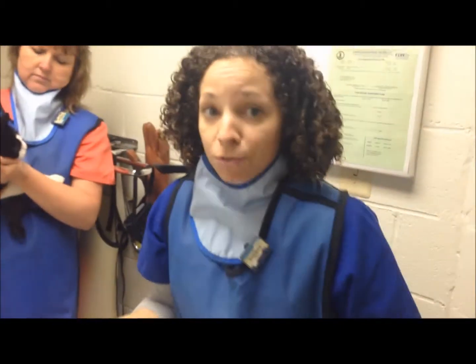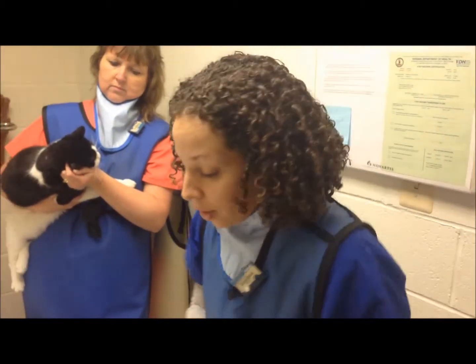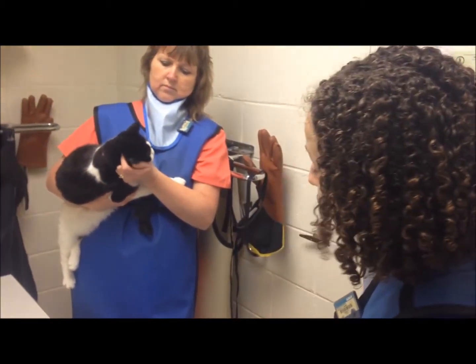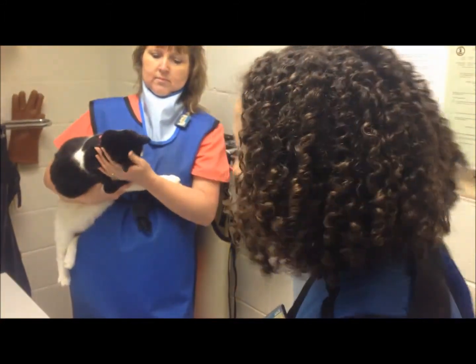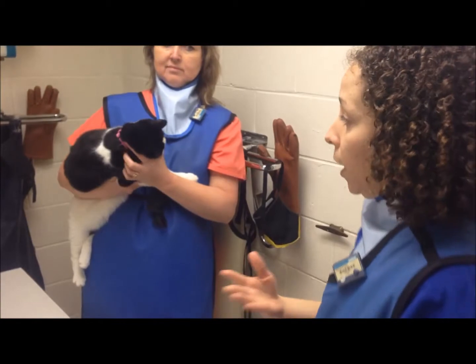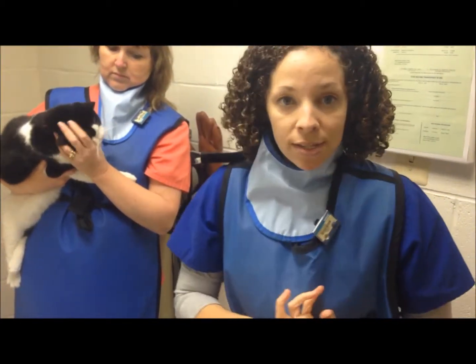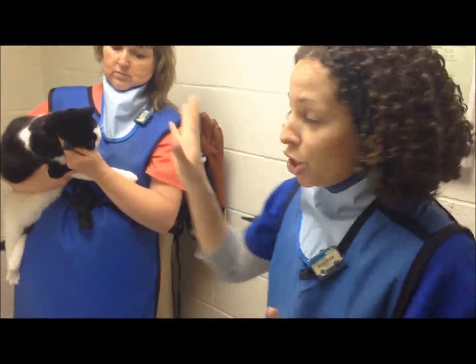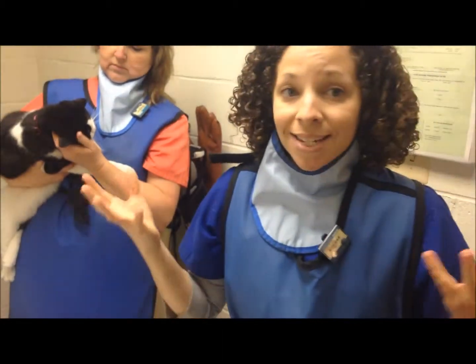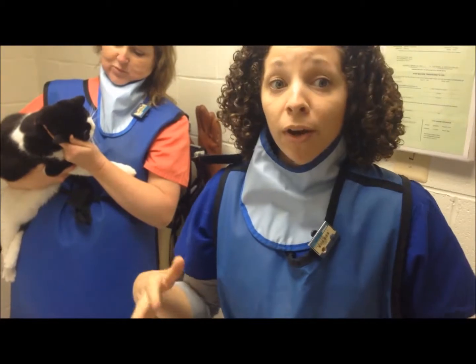And for both canine and feline patients, your upper GI contrast study is complete once you see the barium in the colon. So that's essentially the intervals that you need to do in order to do the contrast study. And as far as labeling, all of the x-rays for any patient will have the patient's name, the clinic name and address, your technical factors that you've used for your machine, and most importantly, a time stamp to denote when each x-ray was taken in relation to when the barium was given.